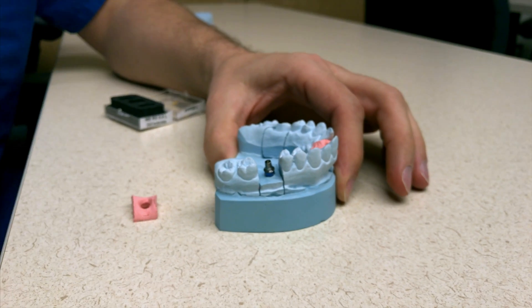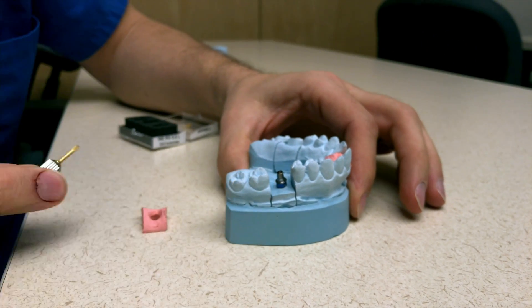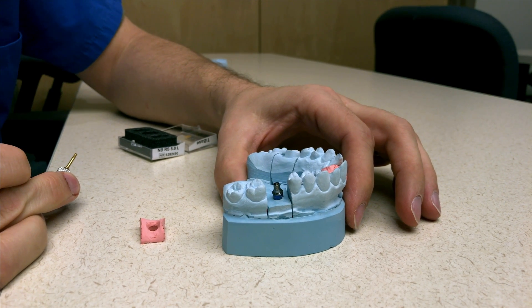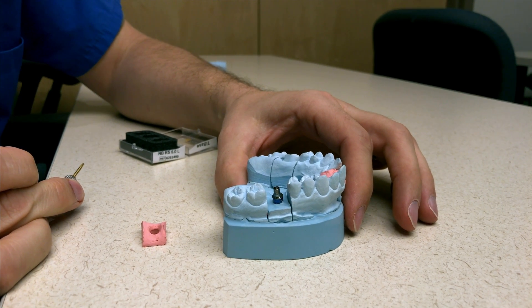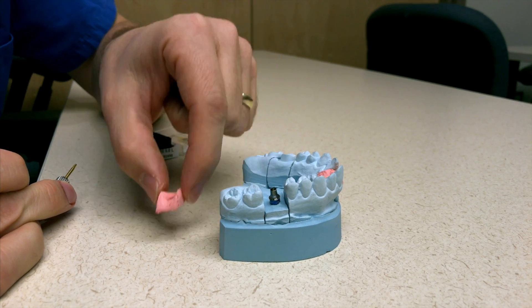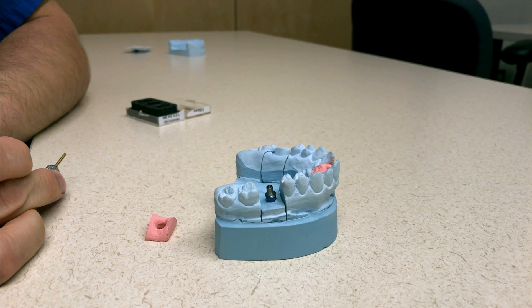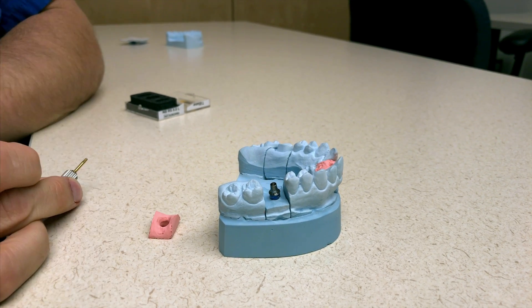You'll see that the platform and the tie base connection is flush. That's why it's important to do a gingival mask. If you did not and you were guessing, you would not know that it's fully seated in the lab. If you remove that gingival mask, it shows you and gives you that window.